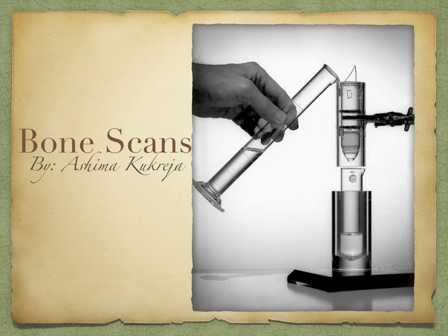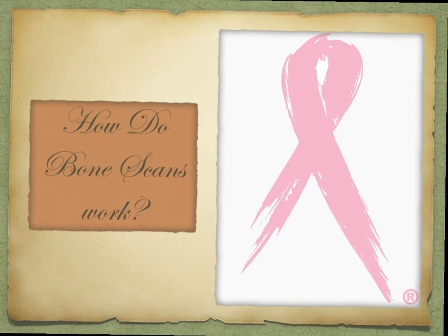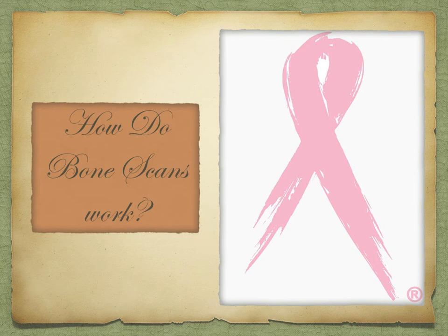A bone scan can be used to diagnose the following few problems that can occur in the human anatomy. It can help to diagnose tumors or cancers such as breast, lung, prostate, thyroid, and kidney, also a fractured bone, infection and the cause of bone pain. As well as it can help to determine if cancer started somewhere else within the body and evaluate metabolic problems, dysfunctions. As well as bone scans have the ability to diagnose tests substantially earlier than regular x-rays.